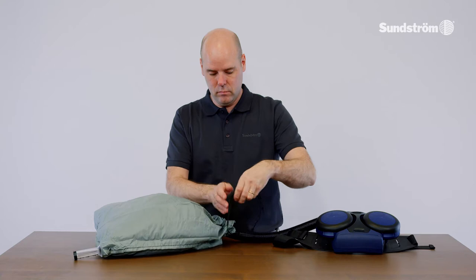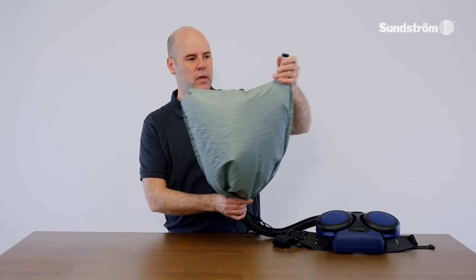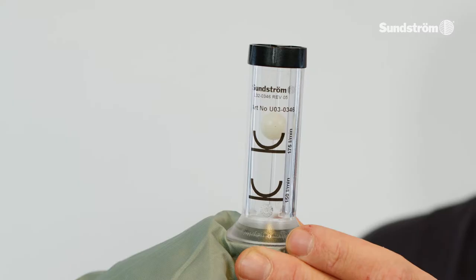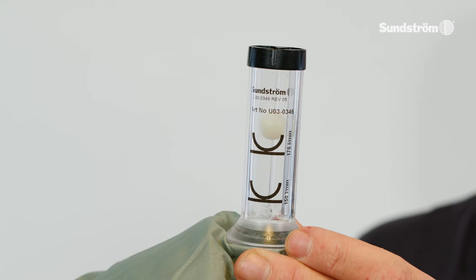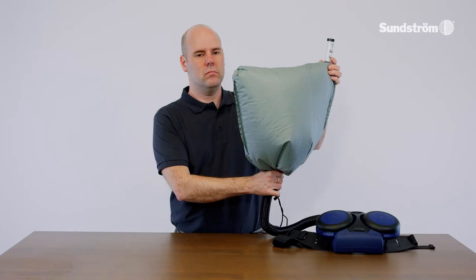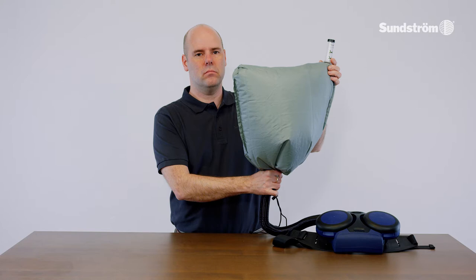Grip the bag to seal around the breathing hose. Grip the flow meter tube with the other hand — the tube will point upwards from the bag. Read the position of the ball in the tube. It should hover at a level with or slightly above the upper marking on the tube, at 175 liters per minute.